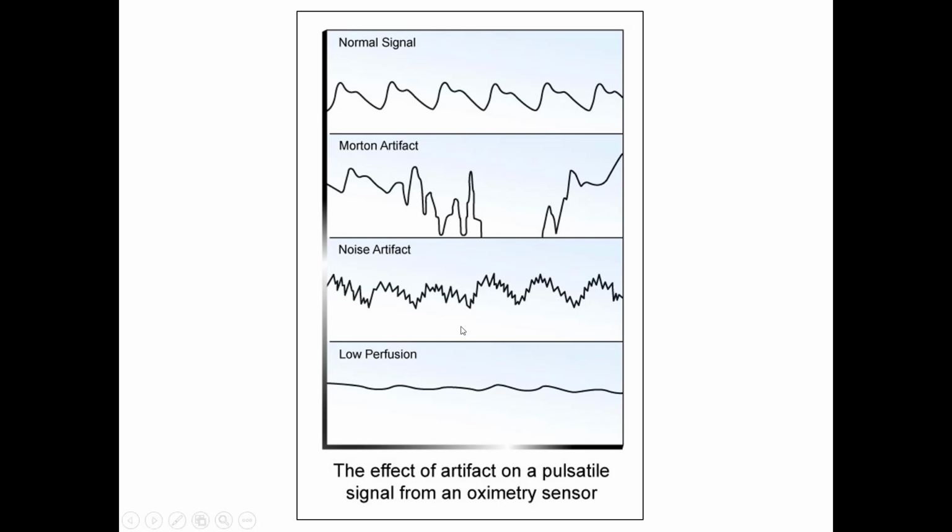As we see in this chart, this is a normal signal. As we said, to have a good design of a pulse oximeter, we have to address two parts. The first is the electronics, as we said in the block diagram, and the other is signal processing, which is very important in the design of the pulse oximeter. We should have a good background in signal processing. This plethysmographic curve represents the oxygen saturation in the blood. This is a normal signal, with AC and DC components.